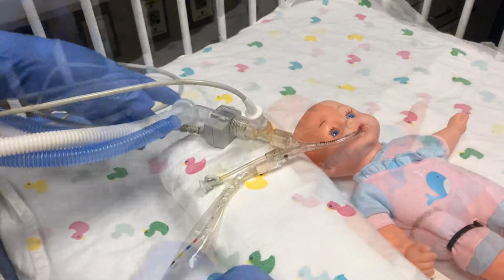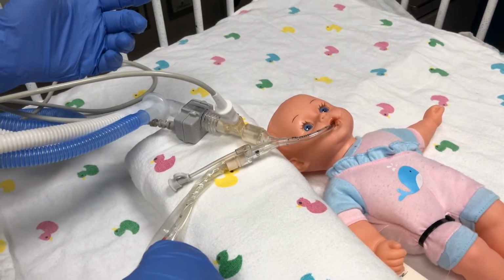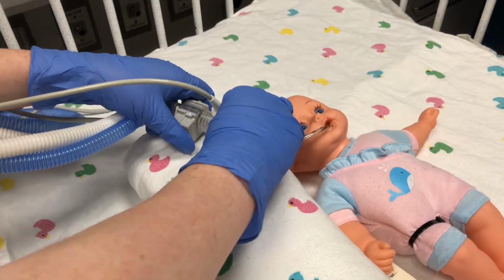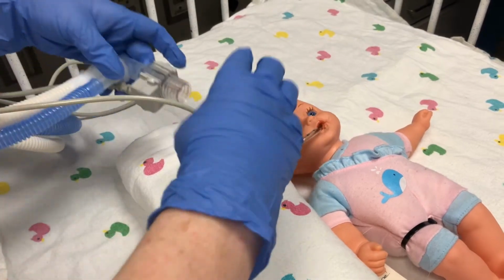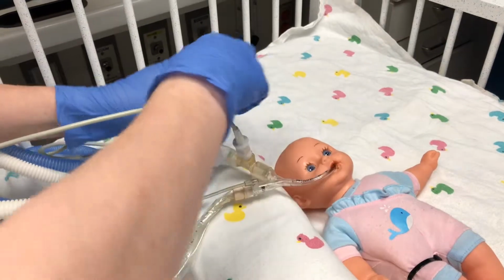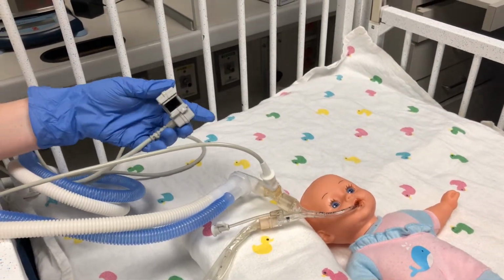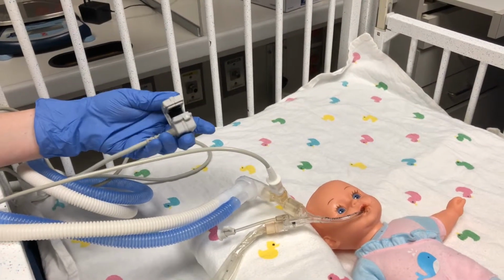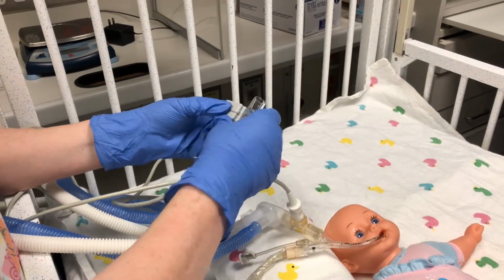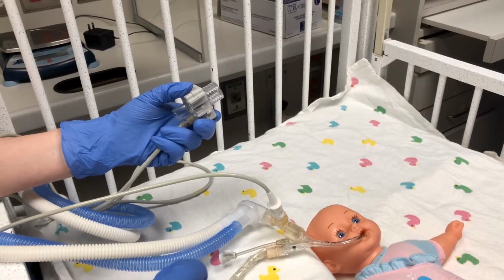Okay. So if you continue to get that message throughout the shift where you need to recalibrate, the best option then is to grab a new adapter, and it's going to be the clear adult one. So you'll just get a brand new adapter. The clear one's disposable, so you can just throw it away in the trash. Then once you get the new adapter, you'll just simply insert it. And then you will have to calibrate it again before you put it in line.